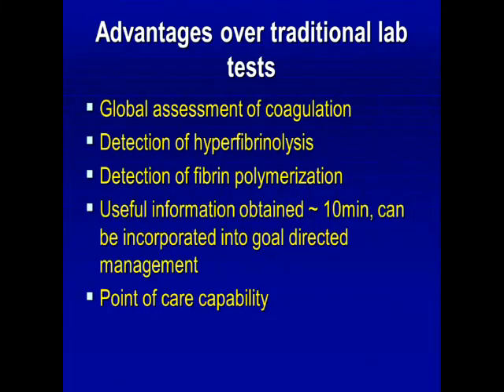In terms of speed, it's much faster than the traditional coags, even in a massive transfusion protocol where the labs are expedited and you've got a dedicated porter. If you've got this at the bedside, which you can do because it's a point of care device, once you start running it you can get useful results within 5 to 10 minutes. Some centers in the U.S., especially big trauma centers, park these machines in the trauma bay. They've got them in the cardiac OR, as St. Paul's does here. You can also put them in a centralized lab so that anybody can use it, similar to the way Vancouver General has it set up currently.